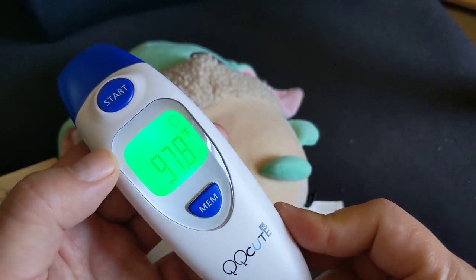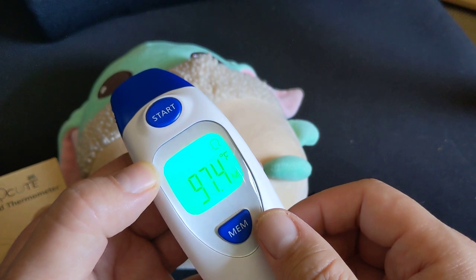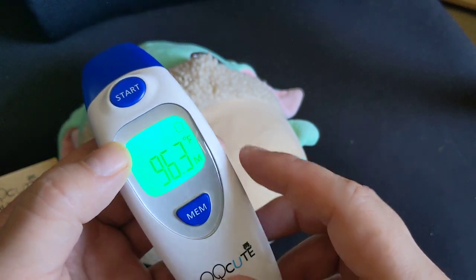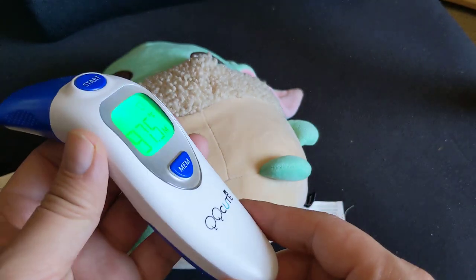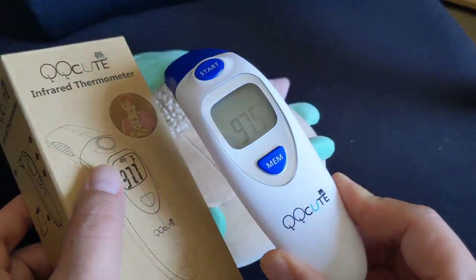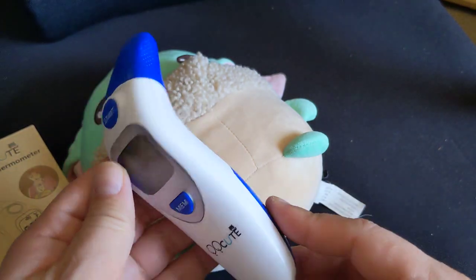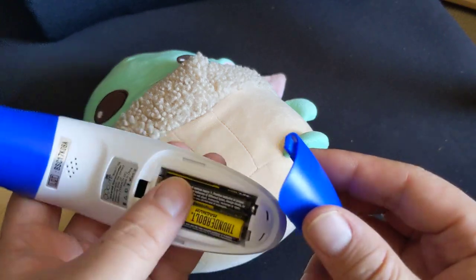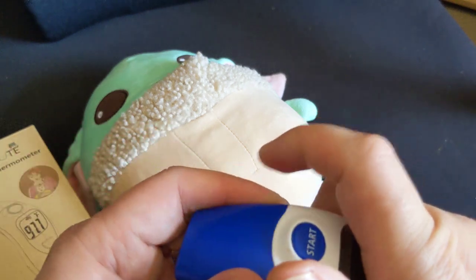So this thermometer was doing readings below the actual value. The lowest was like 97.4 — I even have a 96.3 here. I have a second one because these were literally just twelve dollars each with a coupon code. I still use them from time to time, but I've since purchased more accurate infrared thermometers.